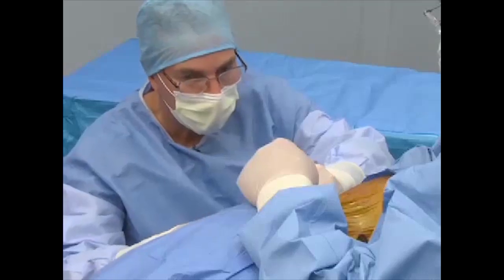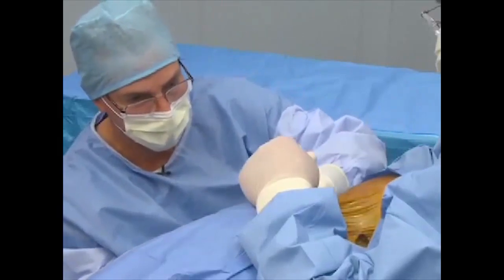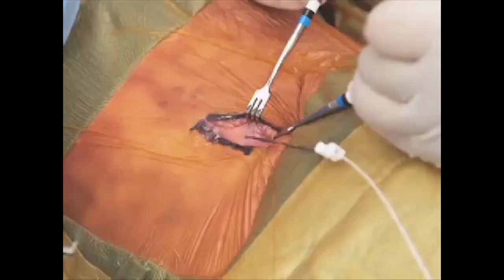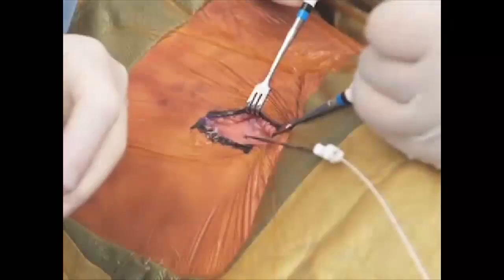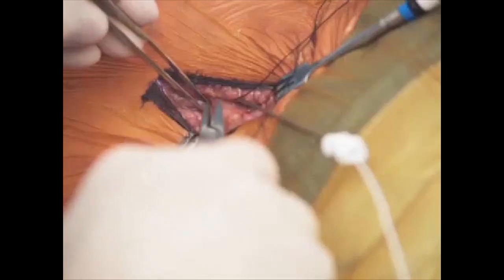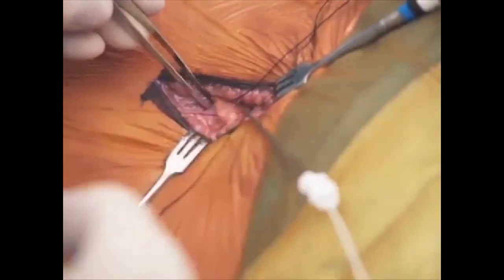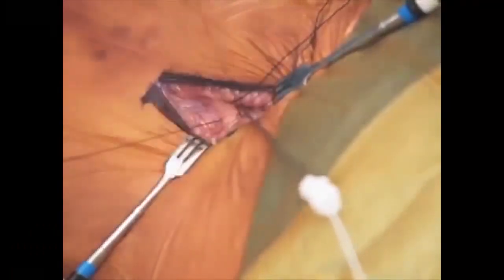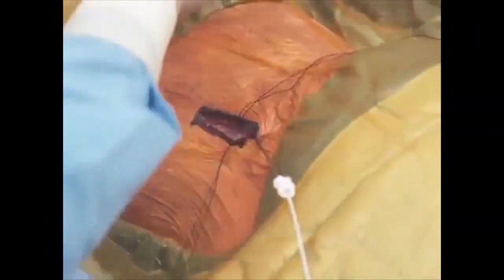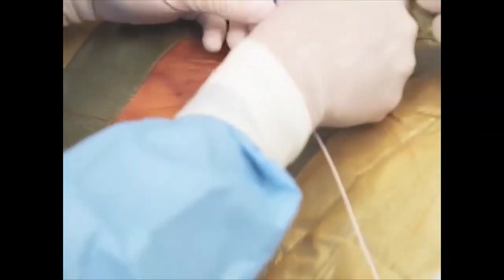With the needle still in place to protect the catheter, prepare the anchor site by making an incision that exposes the lumbodorsal fascia. The incision should be long enough to permit placement of the anchor, and in some instances, the catheter connection, without introducing kinks or sharp bends into the system. Using heavy, non-absorbable suture thread, place 2 tie-down sutures adjacent to and on opposite sides of the needle entry point. Place a purse string suture on the fascia around the catheter, but do not close the fascia at this time.